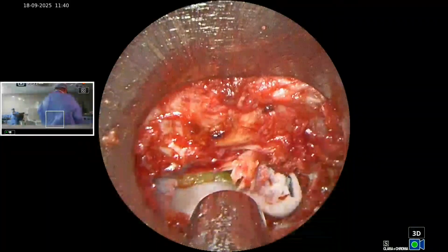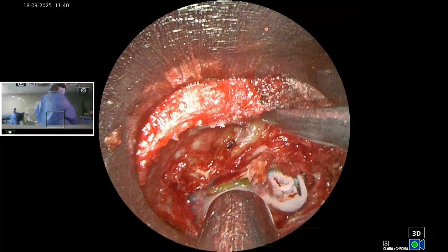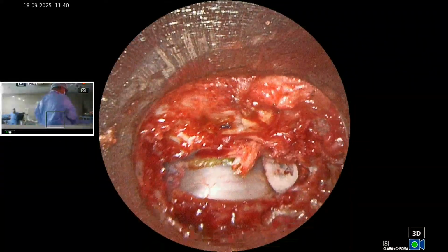This is not the dura. Dura is here. Yeah. 45.